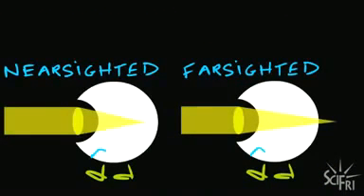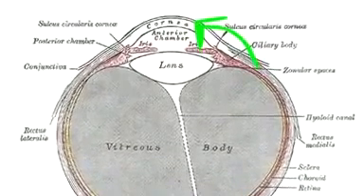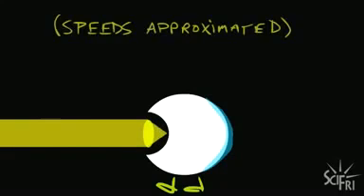By doing laser vision correction, you do what glasses and contacts do. You change where the light focuses. By zapping the cornea with a laser, you can change the position of that focal point. You can think of light like a pack of runners, and the cornea or the lens like a mud patch. The runners start from the same place and move in lockstep until they hit mud, and they're slowed down. Because of the shape of the mud patch, some runners are slowed down more than others, and they get out of sync. The same thing happens when light goes through a lens.